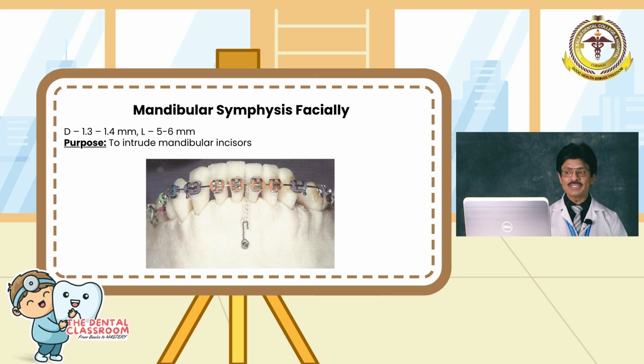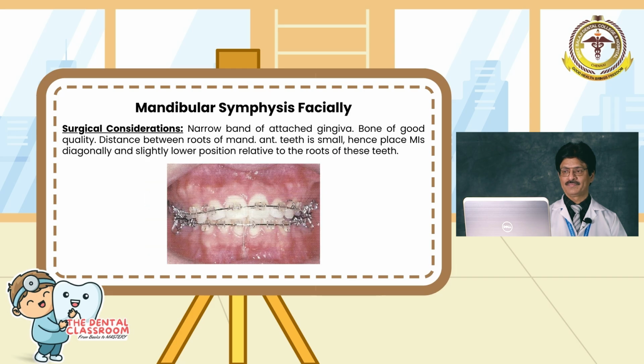Purpose: to intrude the mandibular incisors, as we do the same thing in the maxillary incisors when we place it in between the maxillary incisors. Same scenario for the mandibular incisors too. What are the surgical considerations here?